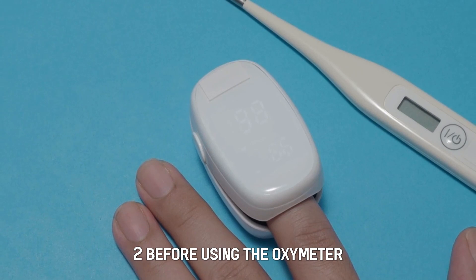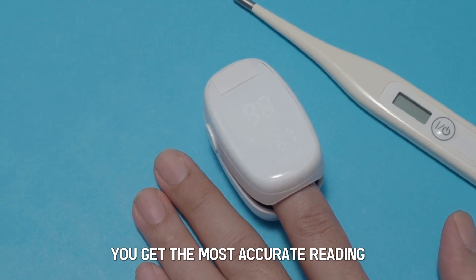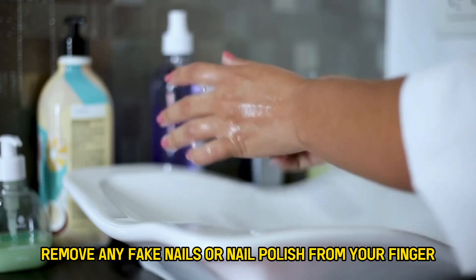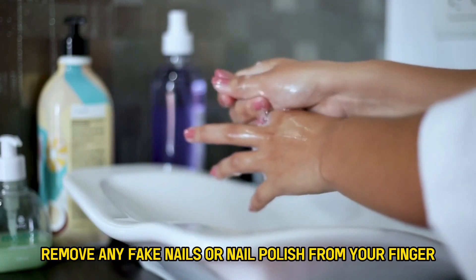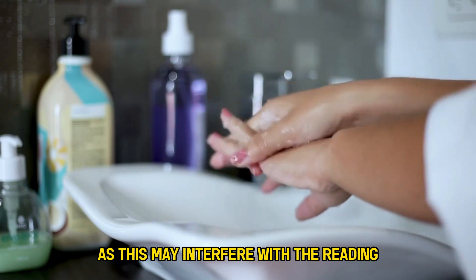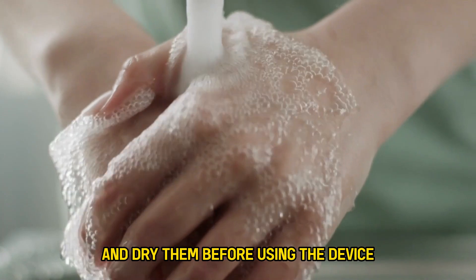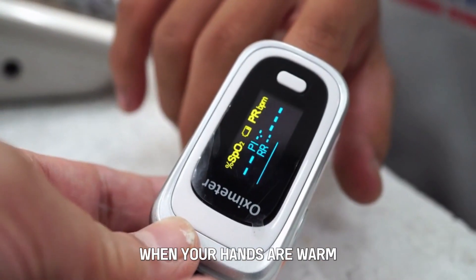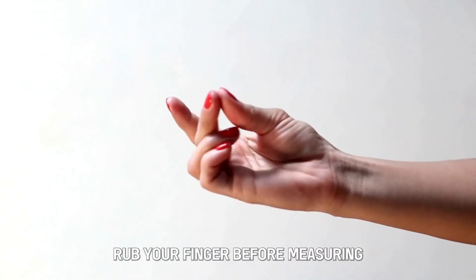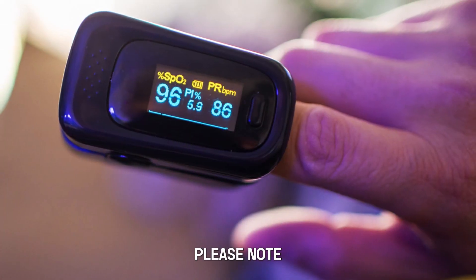Before using the oximeter, here are some tips to help you get the most accurate reading. Remove any fake nails or nail polish from your finger before measuring, as this may interfere with the reading. Wash your hands with warm water and dry them before using the device — the oximeter works better when your hands are warm. Rub your finger before measuring to get the blood flowing.